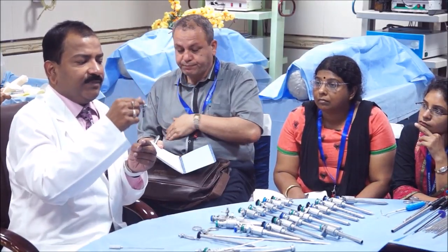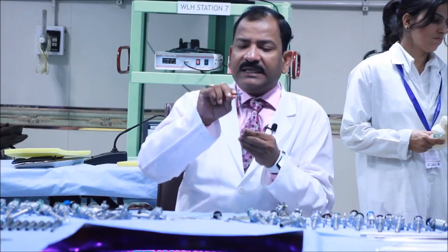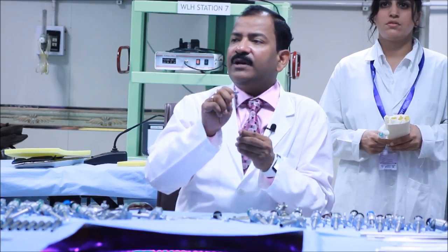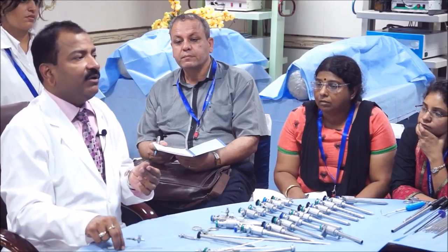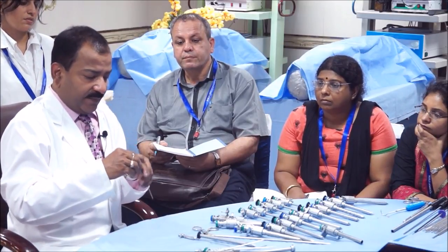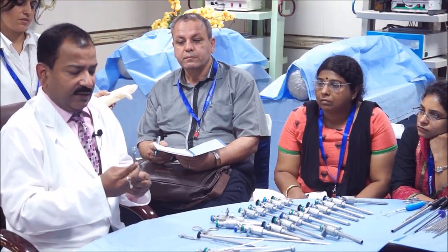This lock, if it is parallel to the stylet, that means it is open. If it is at right angle, that means it is closed. During introduction of the Veress needle, this knob should be open or closed? Open. So that if you enter into any vessel, immediately you will know that I am in wrong place. Now, you have to hold it like a dart. This is the way to hold it.